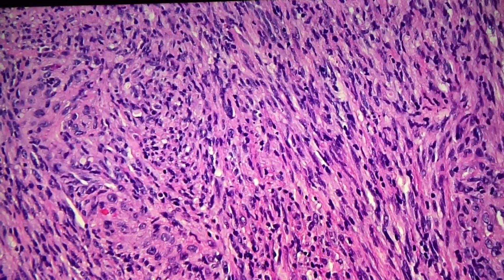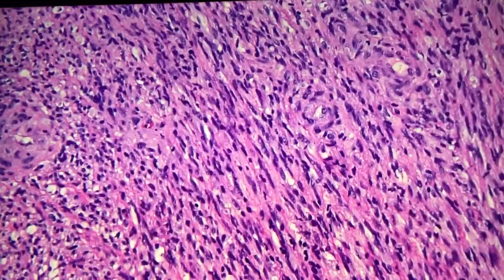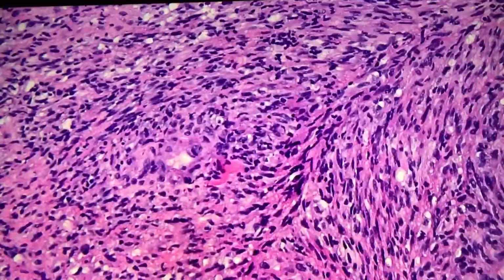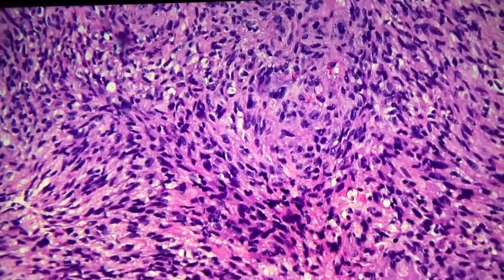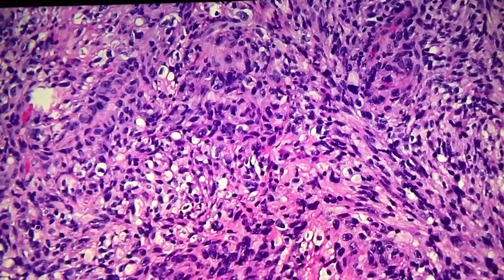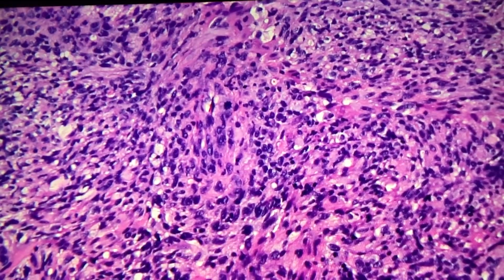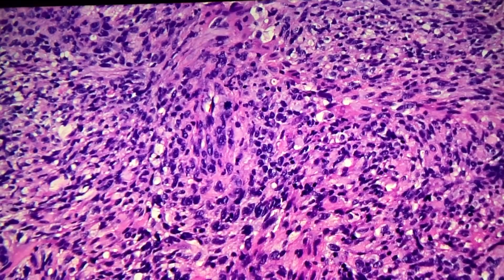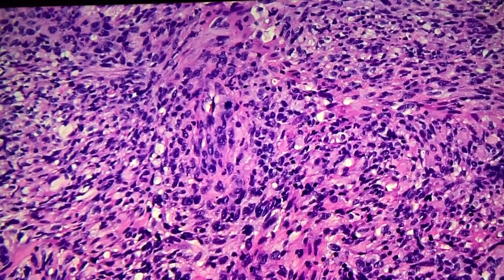I mean, you could say it's not overtly, it's not like an undifferentiated pleomorphic sarcoma, but it's atypical, isn't it? Yes. What is in this figure? Yeah. So now you have a mitotic figure. But you're right that it's a spindle cell neoplasm. Everybody with him so far, right? Spindle cell neoplasm. There is some atypia.